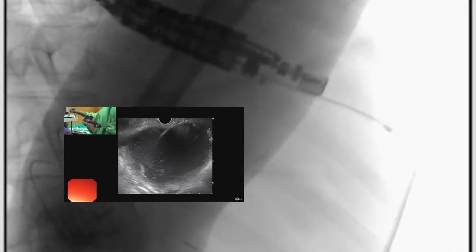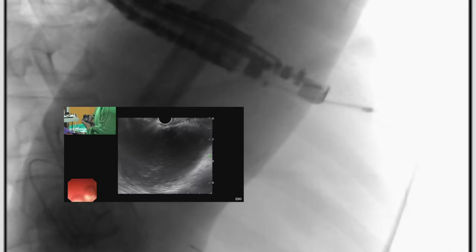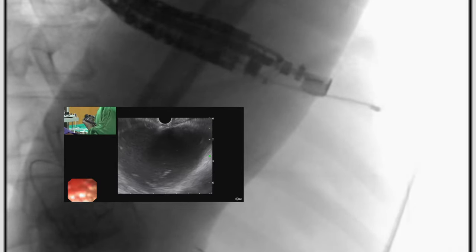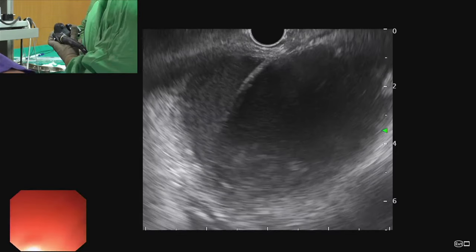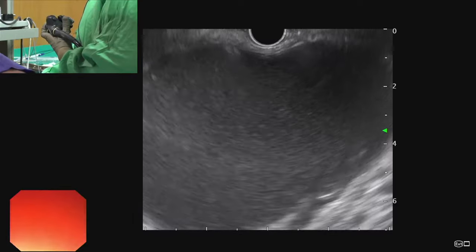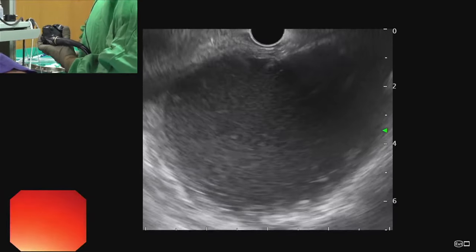We repeat the cystotome pass — we go inside the walled-off necrosis again, making two passes with the cautery current.